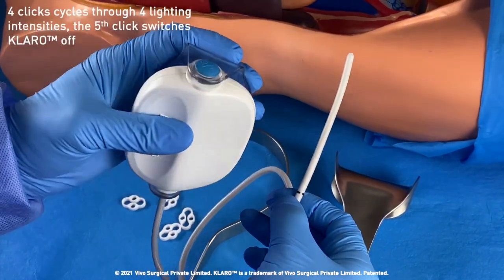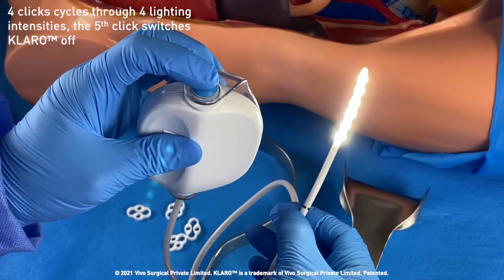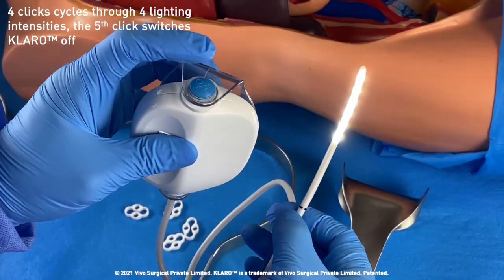With four easy clicks of the power button, four increasing lighting intensities can be selected before the fifth click switches off the device.